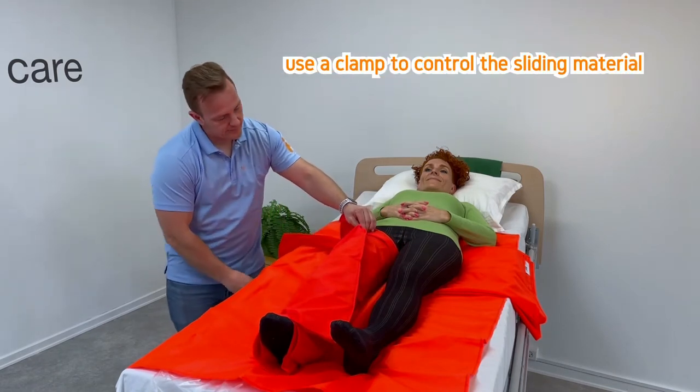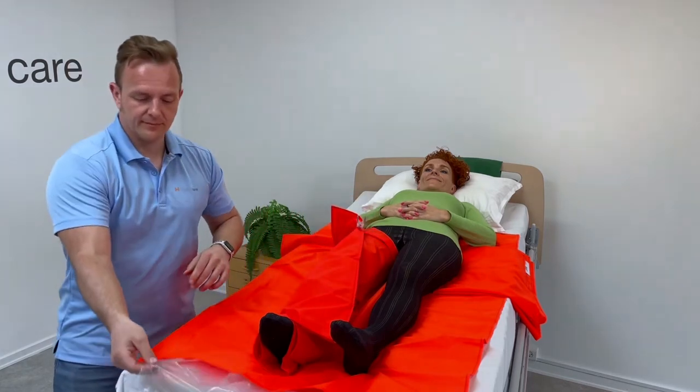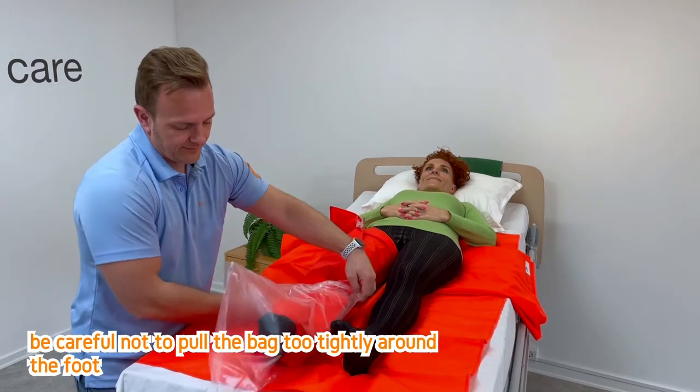Use a clamp to control the sliding material. Put a plastic bag around the foot, and be careful not to pull the bag too tightly around the foot.